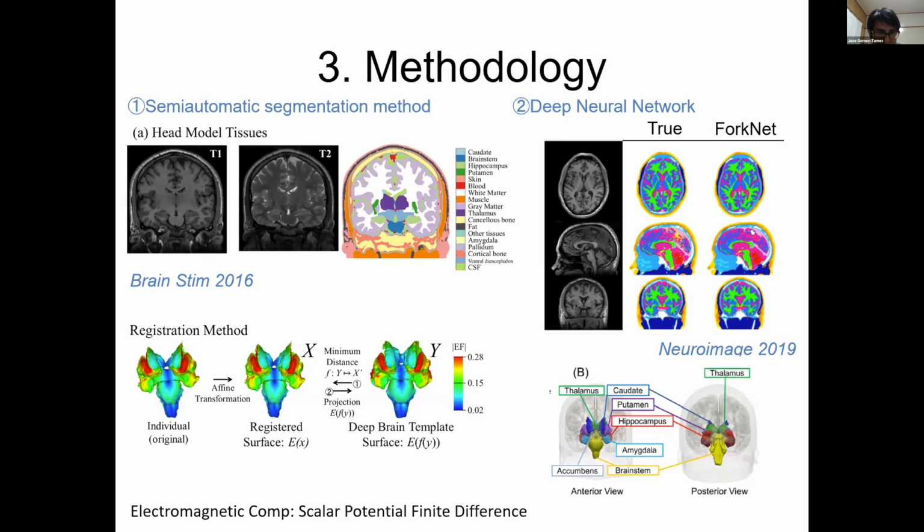For that, we use registration techniques. Very simply, we need to apply some transformations in order to project these fields into a template. Since we then have the information in a template, we can average or apply different statistical methods to investigate the effects at group level. And here is the segmentation for the deep brain regions that we are investigating.